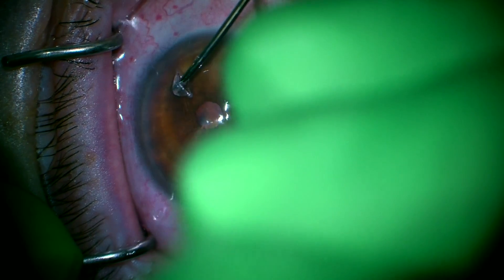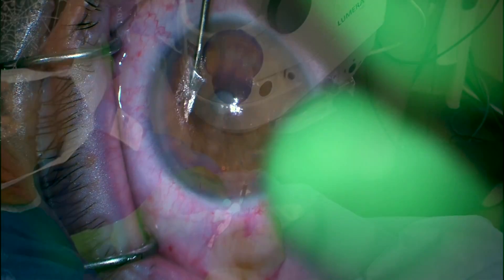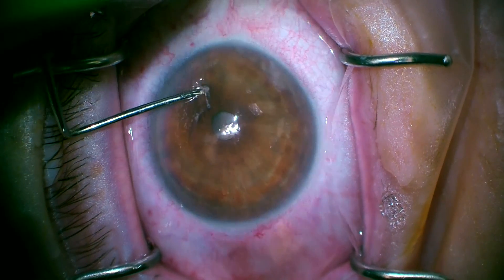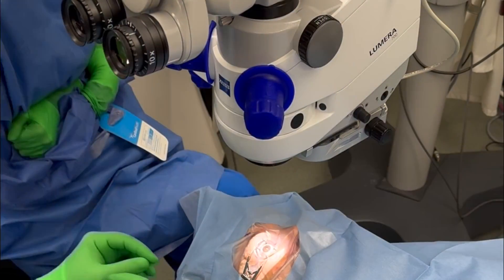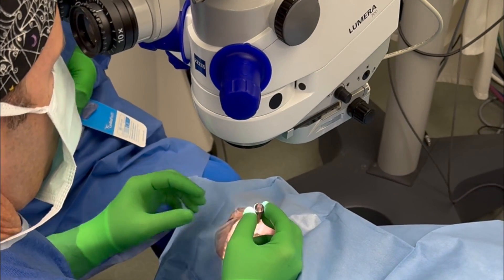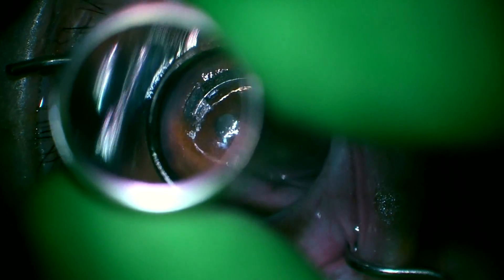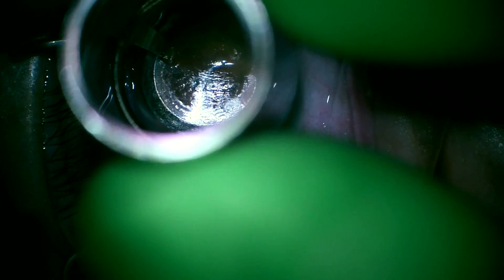Now let's take a look at the cornea. We made these channels in the laser room, and here we're using a little spatula to start opening the channels. The instrument is relatively straight so we can't get all the way around the curved channel, so we go each direction — supra-temporal and then infra-temporal — trying to get them to open as much as possible. Now we're going to resurrect an instrument from the Intacs days and use the channel dissector. Unlike an Intacs segment, which is rigid enough to both dissect and open the channel as it's inserted, the CTAC segment is corneal tissue with very little rigidity, so we need to make sure these channels are fully opened using the dissector.